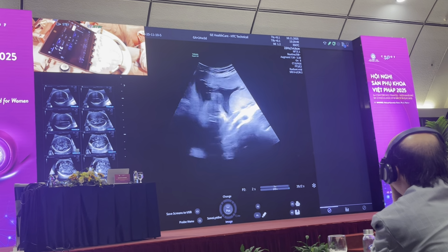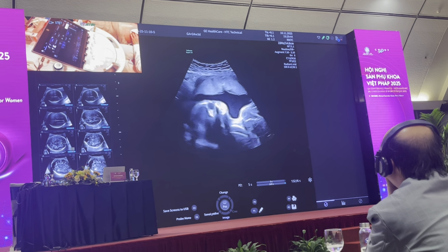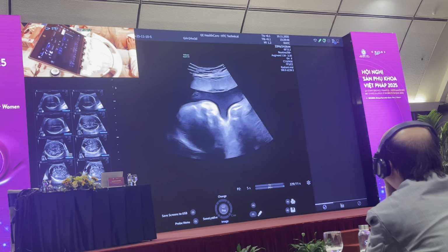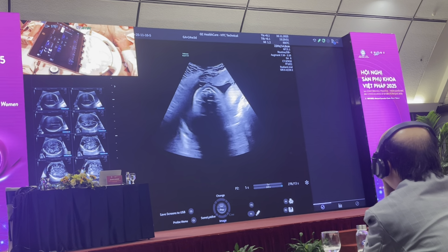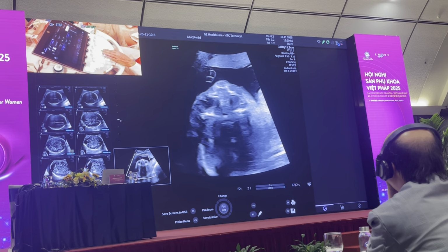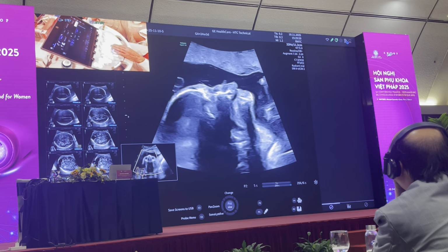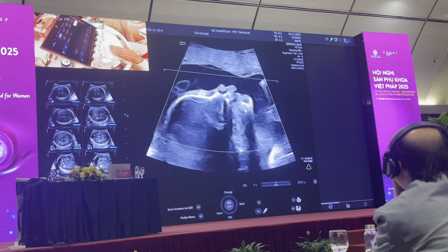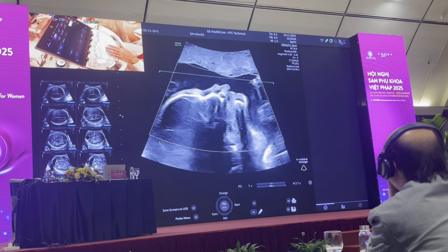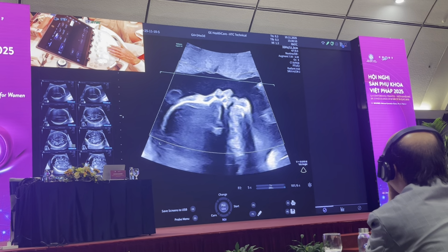Again, I'm going to go back, push the baby's face up, and take a quick profile, so I can have a profile of the baby. So as I magnify the image of the face, just take the weight off the transducer, see the symmetry of the orbits, and then I'll take 90 degrees. When I look at this point here, the required volume, I select volume max on an angle. I check to see whether there is any evidence of a slight recession to the chin.